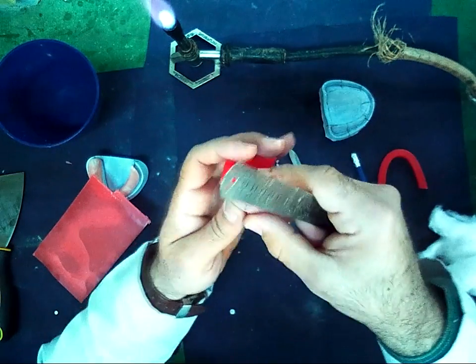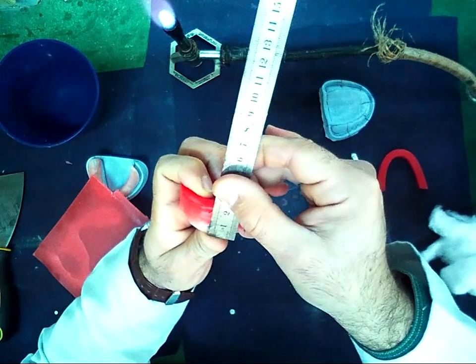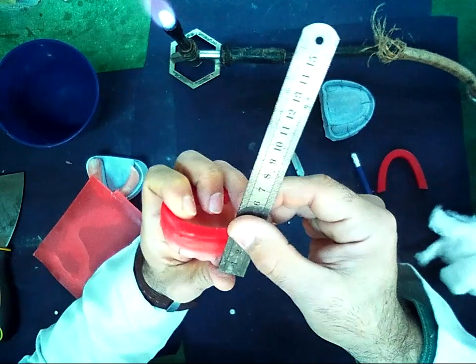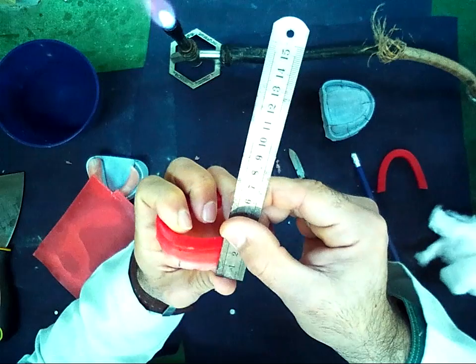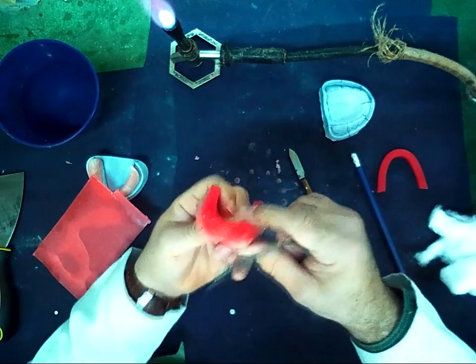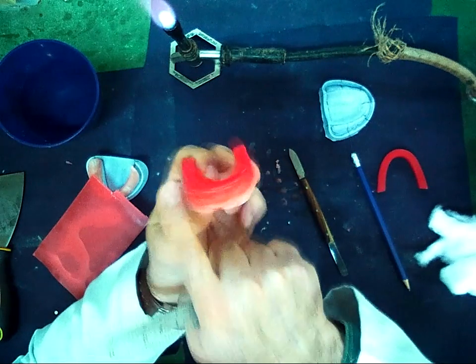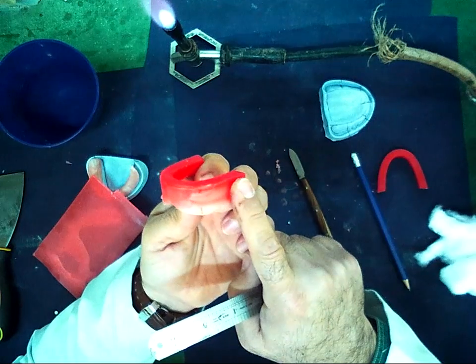On the other side, it is 23, and posteriorly it is 23 also. So I should remove 2 mm, 4 mm, 1 mm, 3 mm.